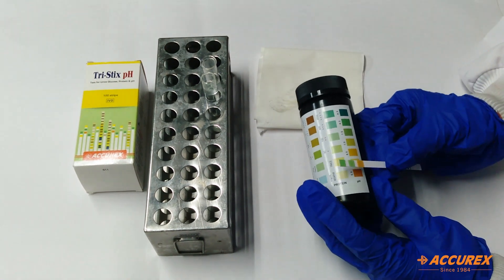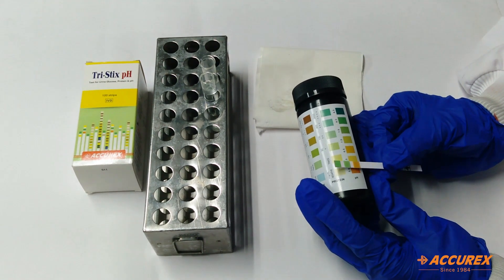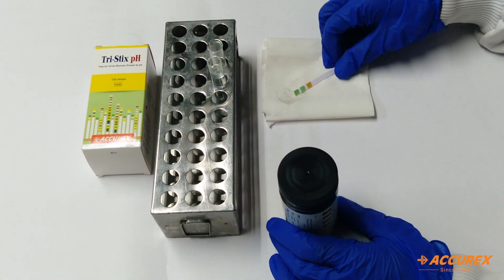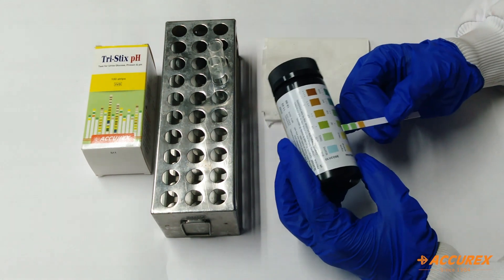Now you can see pH is showing 5.0. Wait for 30 seconds. Now after 30 seconds we can compare the result from the color chart.